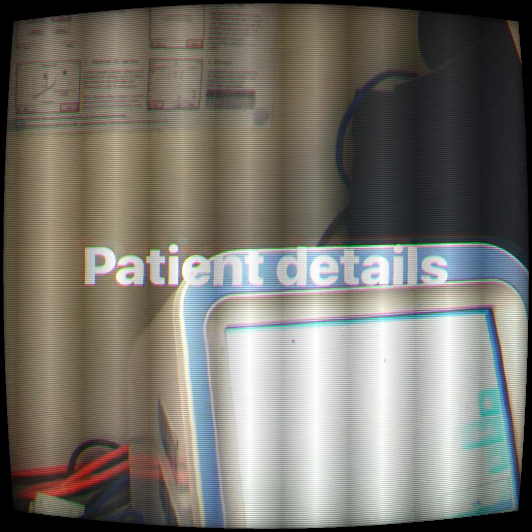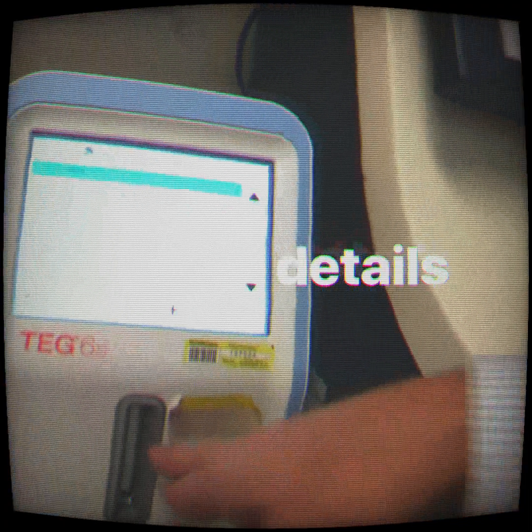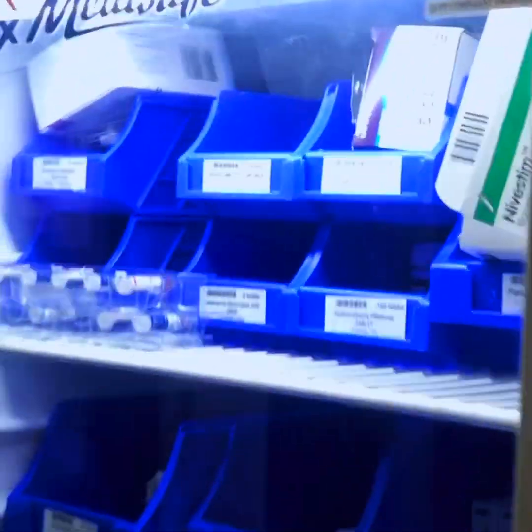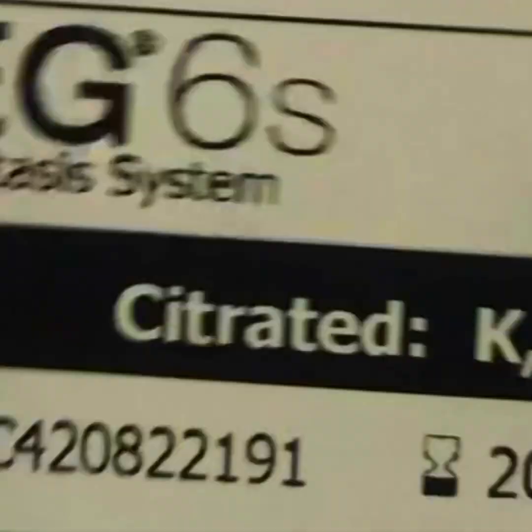Now it's going to ask you for a test cartridge. Go down the corridor into acute care and open the fridge — crack open the door on the left-hand side between A and B, cartridges are on the bottom. Grab one of the test kits.